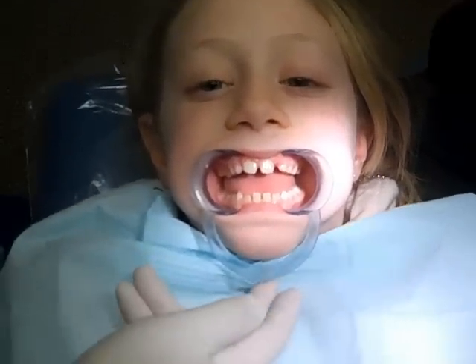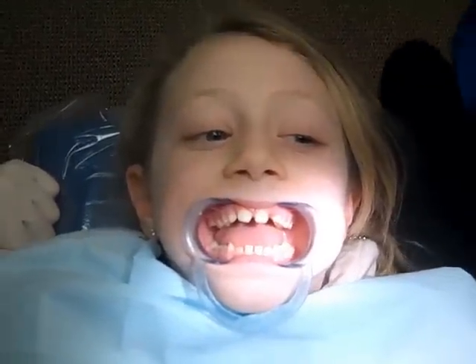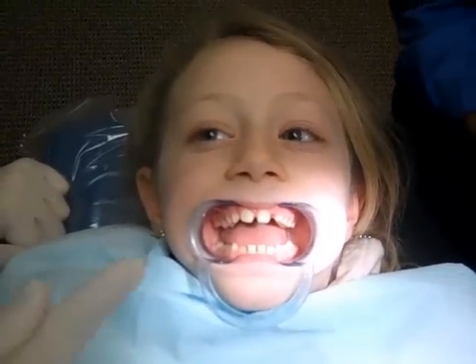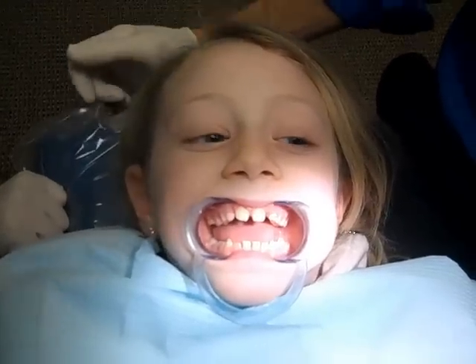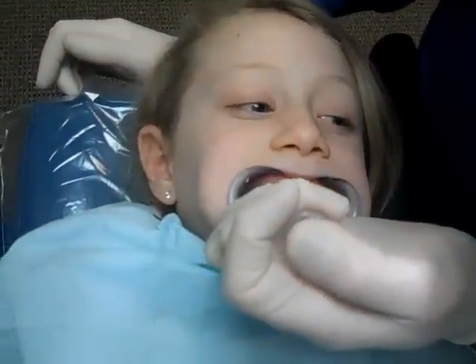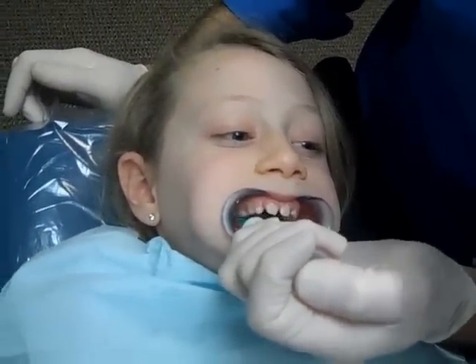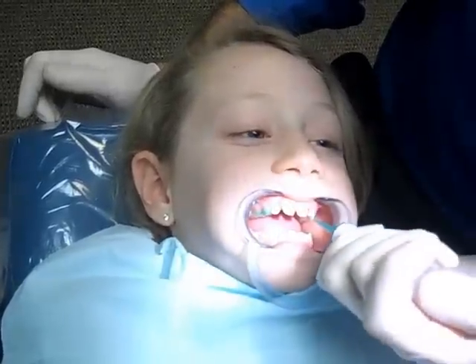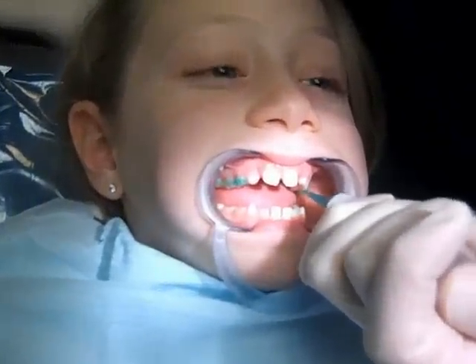What I want you to do is tilt your head back a little bit — perfect — and open as big as you can. This is our green jelly. I'm going to turn this way a little bit — put your head up.